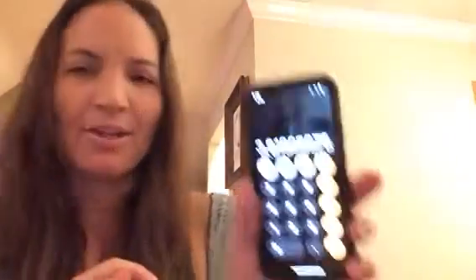My second test strip reads a 111. A 93 and a 111 will yield different calibration factors. I went to my status, then sensor, then down to my ISIG — it's 23.73. On the calculator: 93 ÷ 23.73 = 3.9. My second reading: 111 ÷ 23.73 = 4.6. A 3.9 for me means I've been low and am slowly recovering, or still dropping. A 4.6 means I'm nearing stable again.